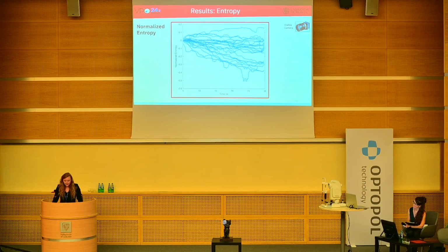Moving back now to the visible camera, two change detection functions are used, the first one being entropy. As we can see, the edges fade away in time, and the contrast between the pixels is diminishing. This reduction in variability also leads to a decrease in the number of distinct intensity levels present in the image, leading to a decrease in entropy.